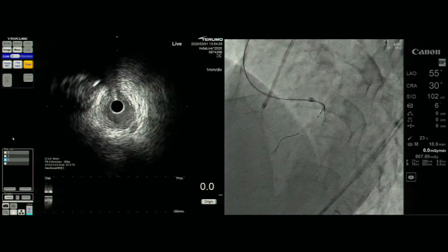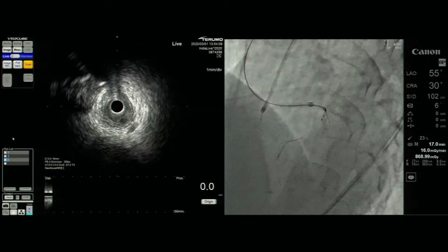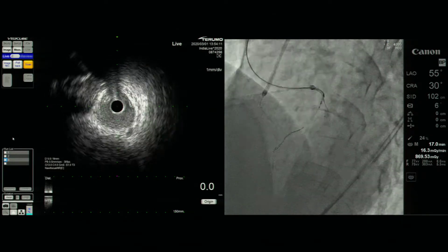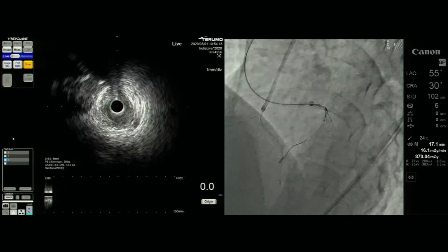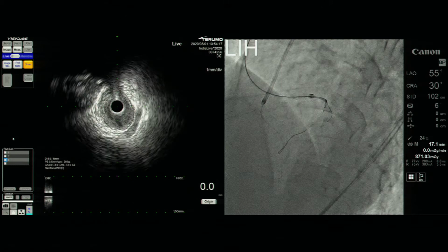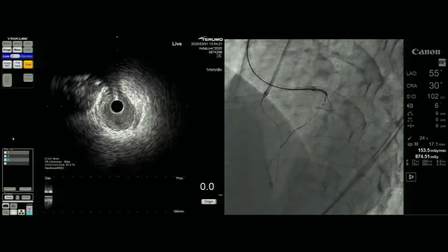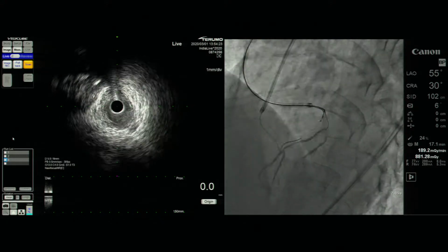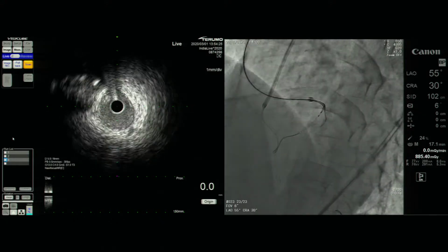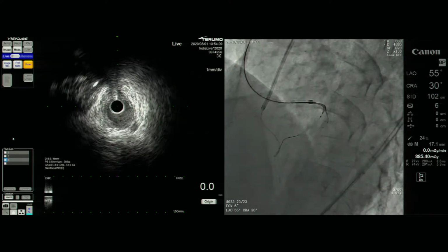It's short. It's the whole channel. Okay. But you could switch now and get the Suzuki on this one and do a parallel wiring? Yeah. Okay, I will change the system.